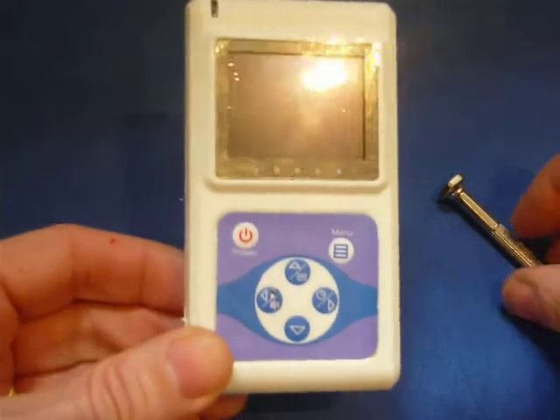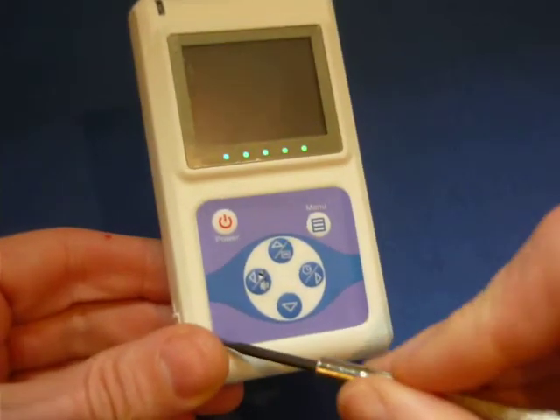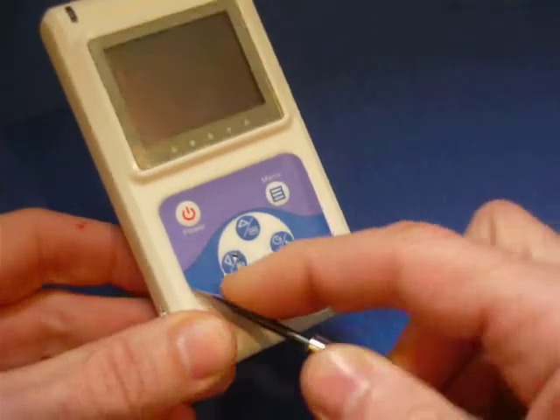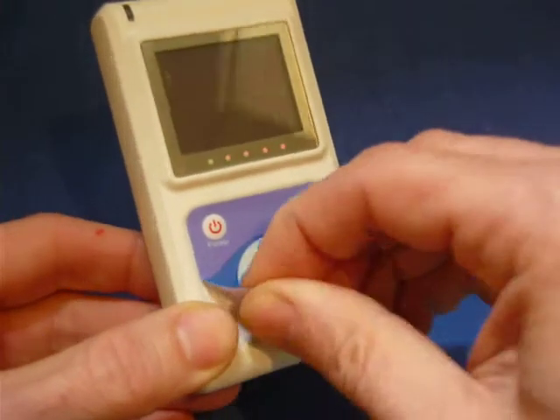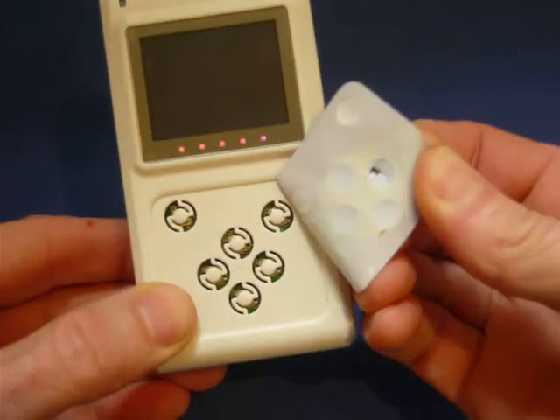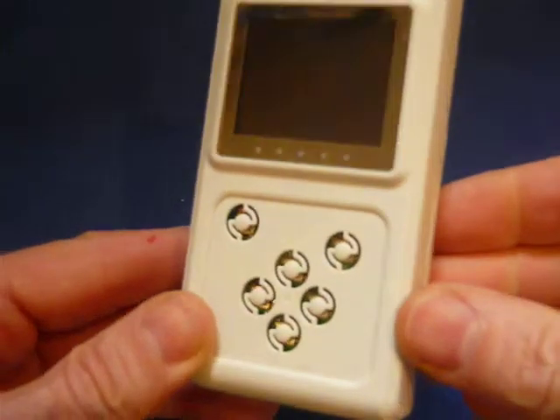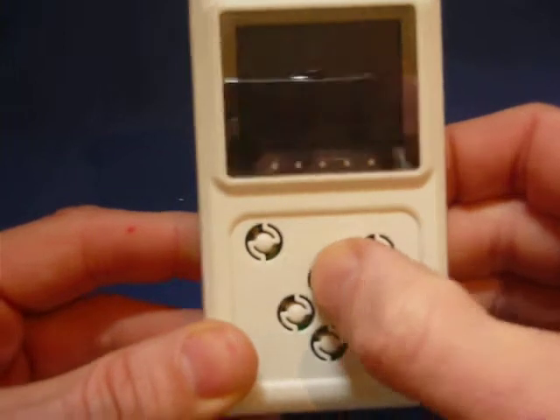Let's replace the label. We can use a blunt instrument to lift up the edge of the label and peel it off slowly. As you can see, the buttons have spring actions designed into the plastic and will last forever.